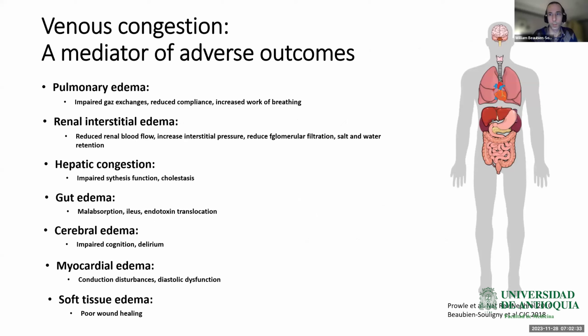Here, the distribution of portal pulsatility before and after bypass is shown. We found that abnormal portal vein at the two time points was associated with longer post-op support requirements after surgery, and its presence post-bypass was also associated with more post-op major complications.